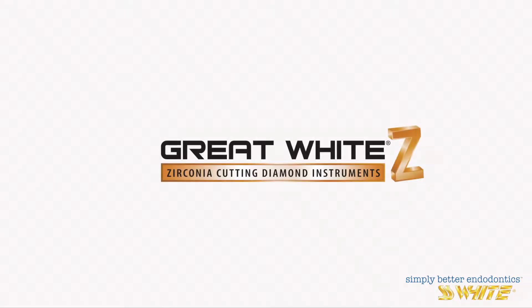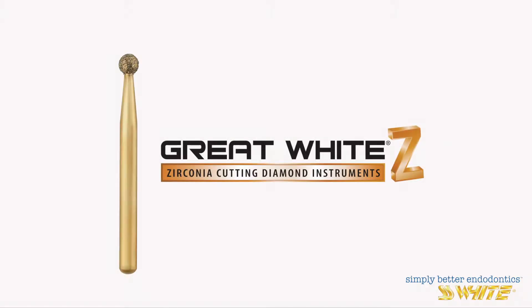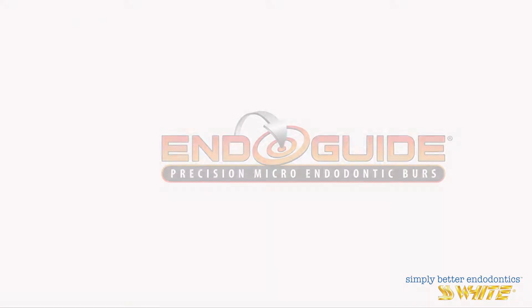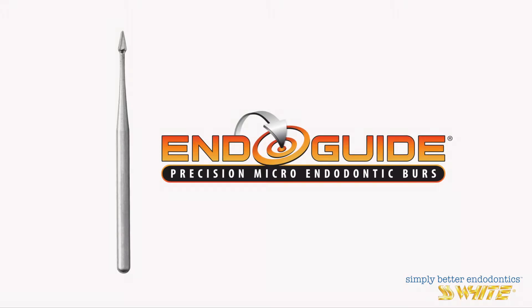We will use the following burrs: the round Great White Z 801 Diamond, the tapered Great White Z 856 Diamond, and the Endoguide EG1A.